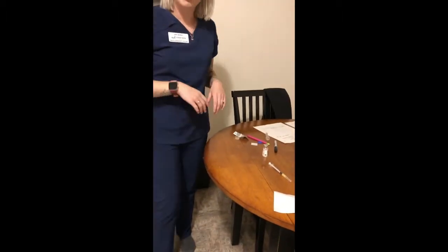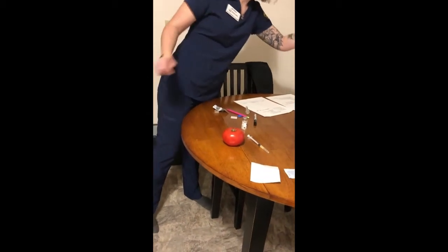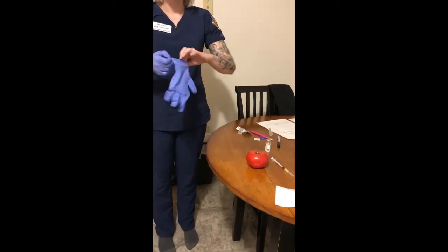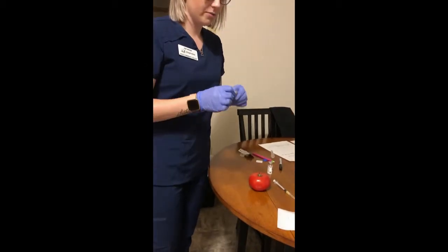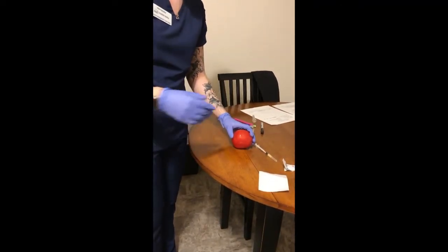So I'm going to get my patient in position. I'm going to put his left forearm out. This is my patient. I'm going to apply my gloves. I'm going to use an alcohol wipe to clean the area. You want to start in the middle and go outward and allow for time to dry.